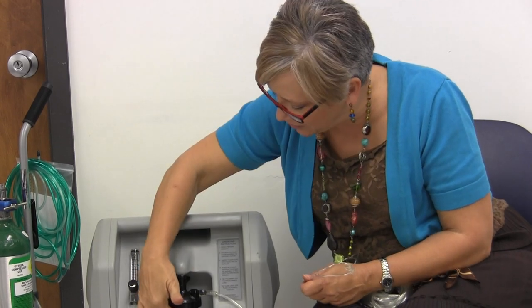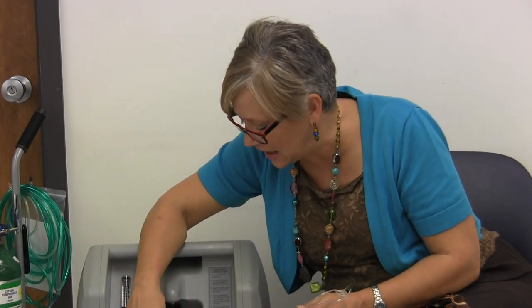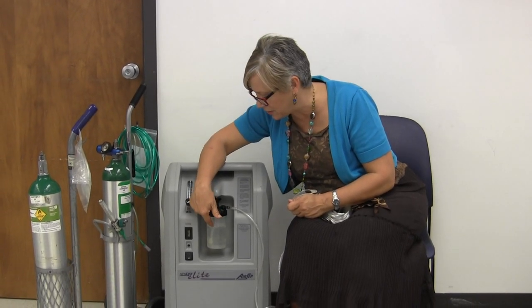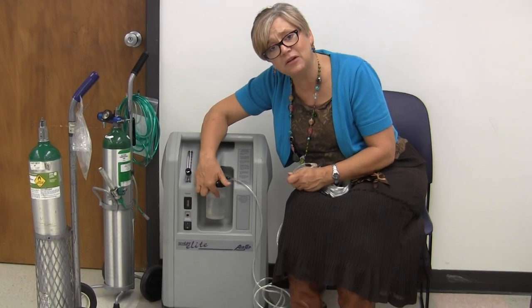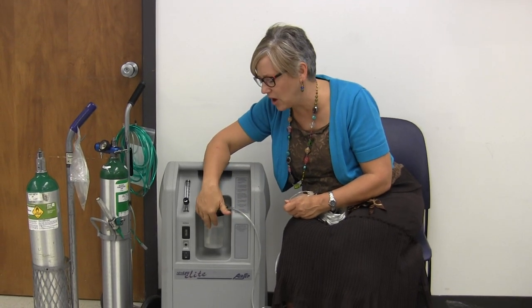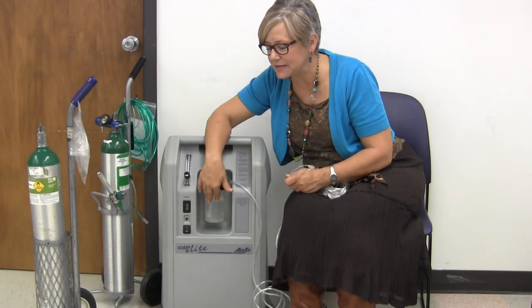Another thing I wanted to talk about is the humidifier bottle. Is it bubbling? Look at it and see. Make sure that it's not too full — if it's too full it's not going to work correctly either. You're not supposed to fill them all the way up. There's a fill line on them. And it's always best if you can use distilled water instead of regular tap water, which will leave deposits, especially in this area of the country.